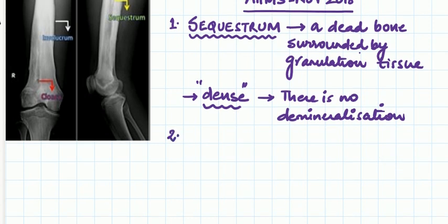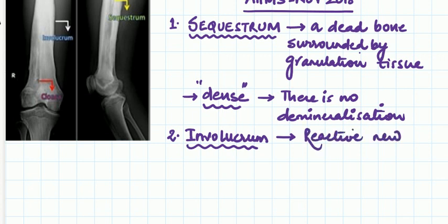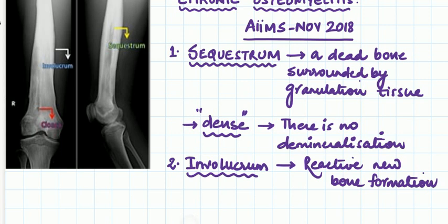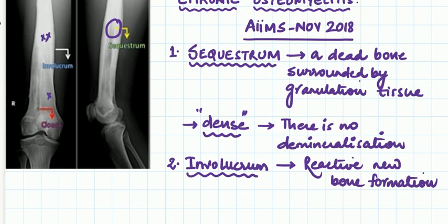The second important structure in chronic osteomyelitis is the involucrum. Involucrum is basically a reactive new bone formation. New bone formation will appear white on X-ray. Looking at this image, all the white dense structure you see here is the involucrum. This is the AP view and this is the lateral view — don't get confused. In the AP view, you can see increased density suggesting a high periosteal reaction, and the bone is also expanded, indicating new bone formation.